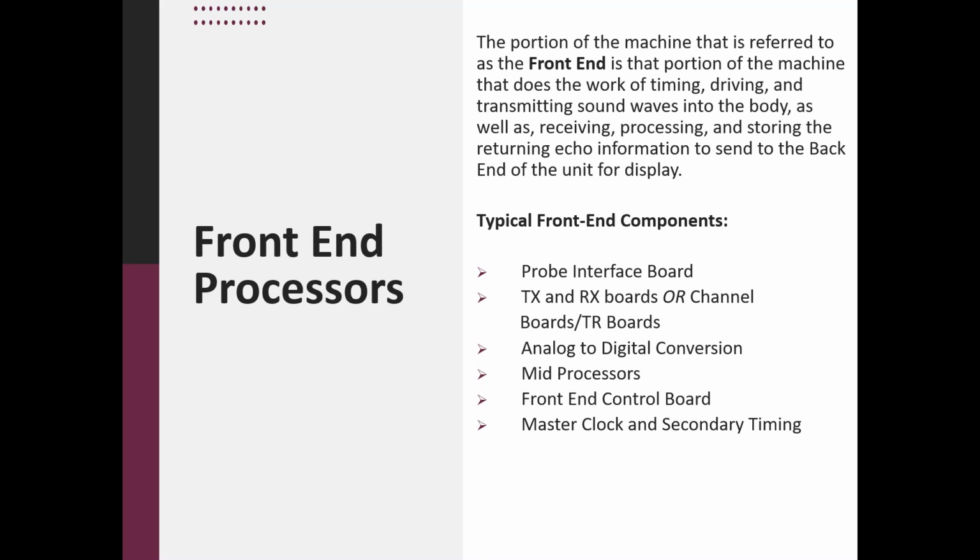There is always some kind of front-end control board that helps to recognize the probe and set the front end up for running that particular probe. And also, it's typically the watchdog of the front end. It checks temperatures and voltages and things like that. And you can't talk about ultrasound without talking about the master clock and secondary timing. It takes an incredible amount of digital timing to transmit, receive, and display an image correctly.